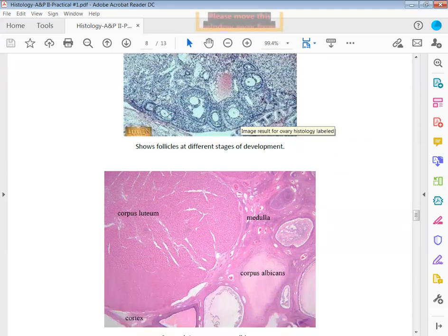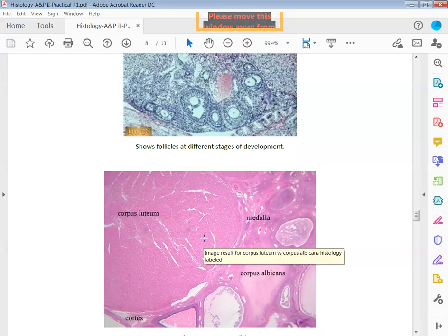After a woman ejects the egg from this follicle, the egg will travel down into the uterus, and what happens is that egg is being released to be fertilized. If the egg is not fertilized, then the egg will pass on through. After that follicle burps out that egg, it's an empty follicle, and it will be reabsorbed into the body. Those empty follicles are called a corpus.